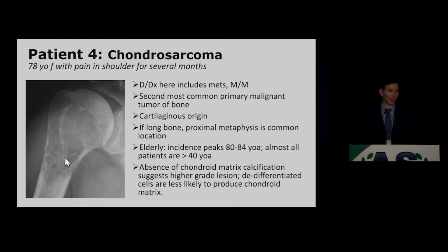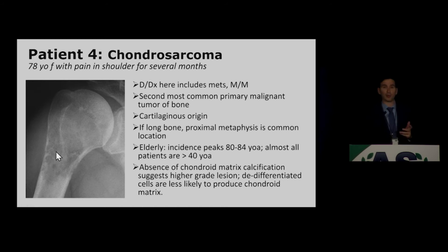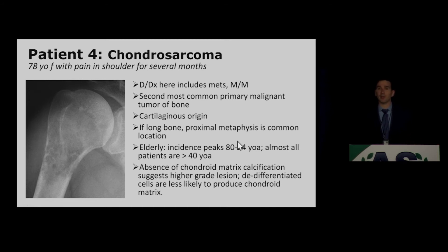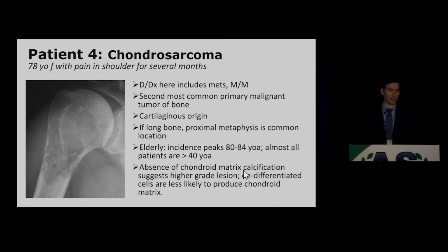Patient 4 is a chondrosarcoma — a very aggressive-looking lesion. It is lytic with no internal matrix, moth-eaten, with areas of cortical endosteal scalloping where the cortex is thinned from the inside, and frank cortical destruction. It is the second most common primary malignant tumor of bone, a tumor of the elderly peaking in the mid-80s — we really shouldn't be seeing these in young patients. The absence of chondroid matrix speaks to a de-differentiated, higher-grade chondrosarcoma, as in this case.